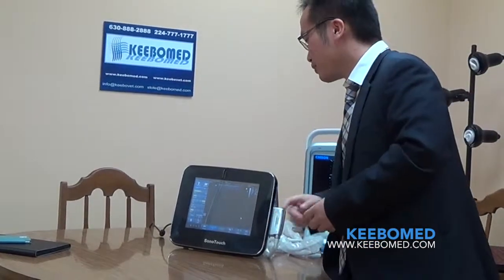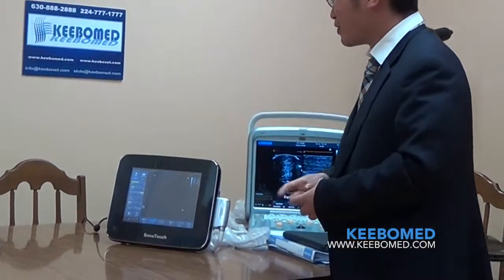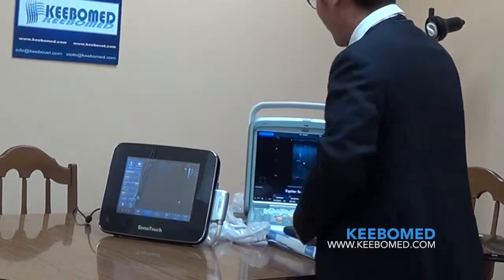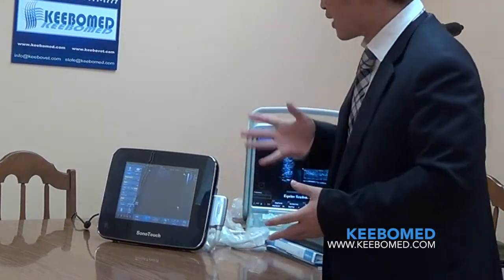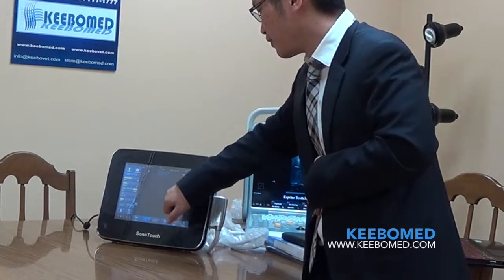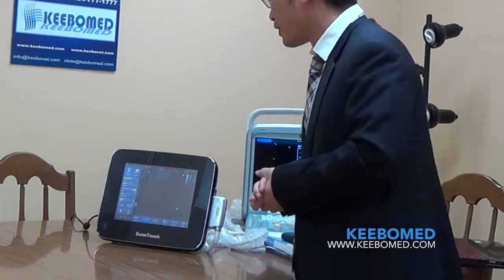Let me show you how to adjust depth. It's very intuitive and easy. Using a finger swipe up or down on the screen adjusts the depth. If you swipe your finger left or right on the screen, you can adjust the TGC. And this arrow here means the focus. If you want to adjust it, just hold on the monitor and the focus will follow your finger. So wherever you want to see, just touch on the interface and the focus will go there.